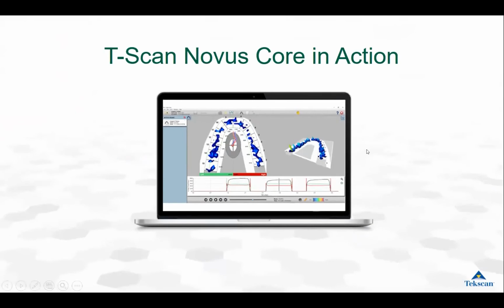And now we are going to take a look at T-Scan Novus Core in action. So my colleague Jen Cullen will pick up from here and show you the T-Scan Novus Core software, followed by some clinical cases. So I'm going to stop sharing my screen and take it away, Jen.